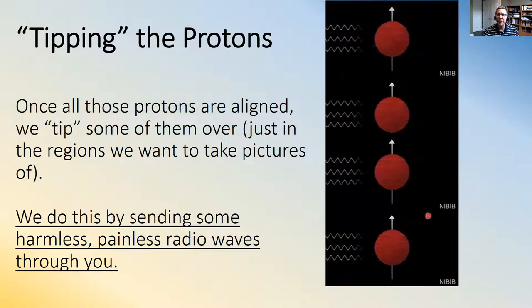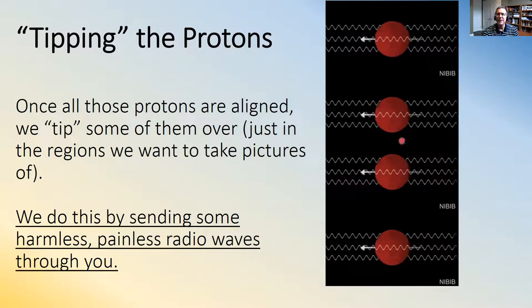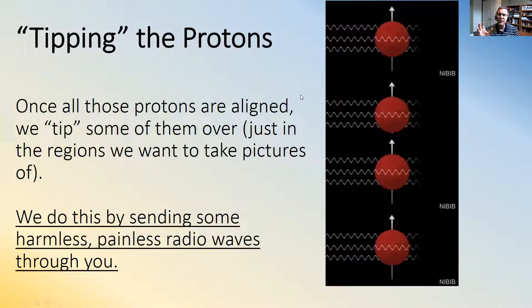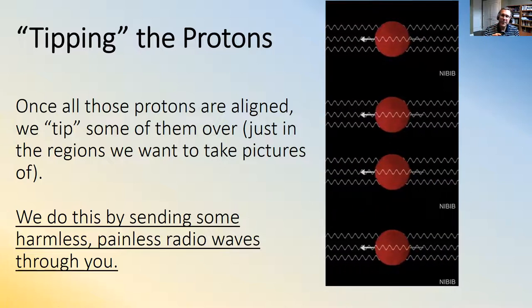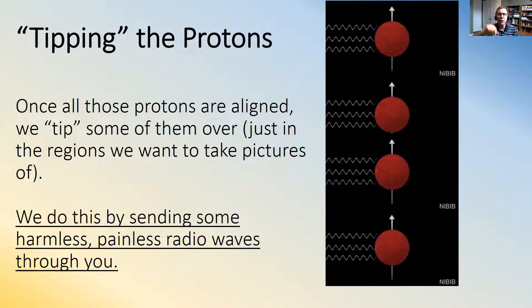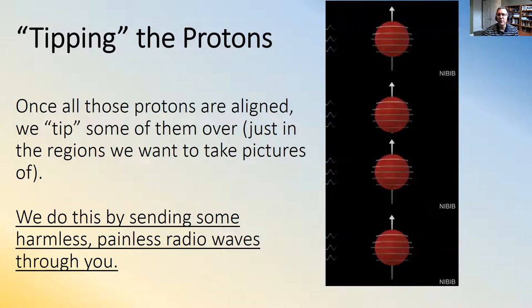Once all these protons are aligned, and in this picture I'm showing them all pointing from the bottom of the screen to the top, let's say that's aligned along the magnetic field. We are going to apply some painless radio waves into your body, and those radio waves are going to talk to the protons and make them tip over away from the direction of the magnetic field. All right. And again, the radio waves are completely harmless as well.